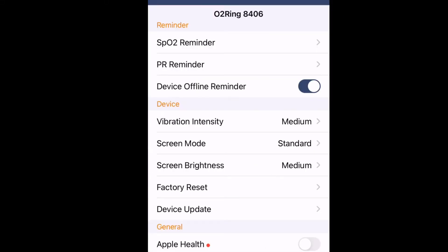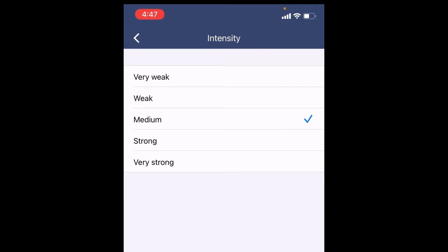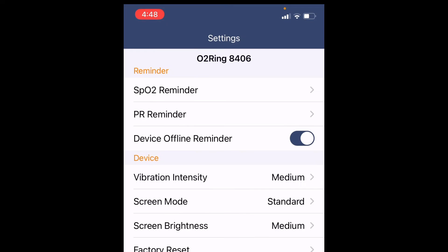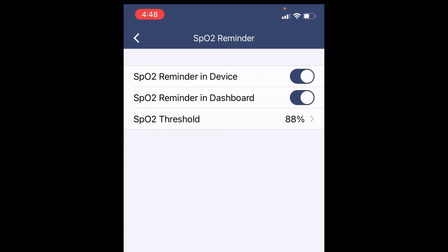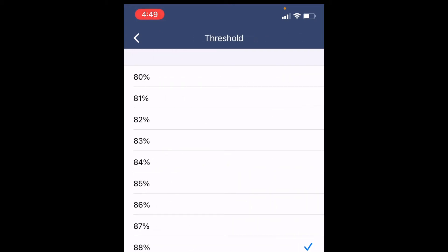In the settings, you can control vibration intensity — it came set at medium, but you can set it to strong or very strong. You can set it to alert you when things are dropping, or the next day you'll see a full report. For oxygen levels, the threshold is set at 88%, so when it drops below 88%, it lets you know. There's no reason my oxygen level should drop below 88% — I want to know if it does. If I sleep on my back, open my mouth, or snore, my oxygen levels will drop, and I don't want that to happen.